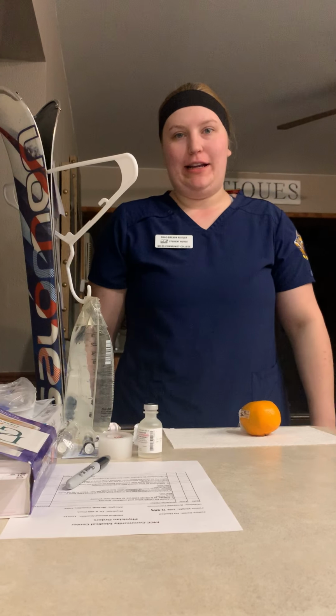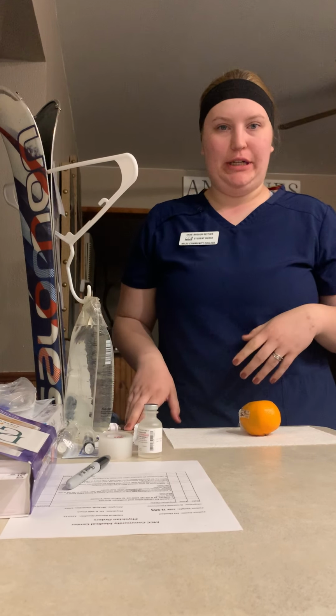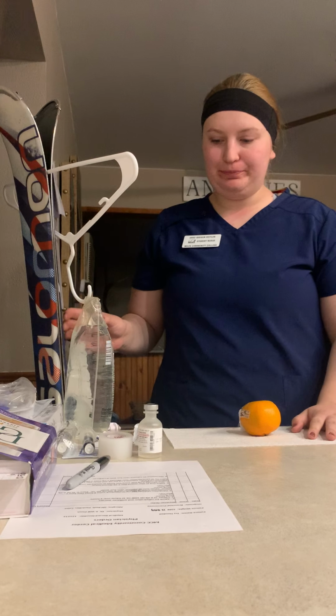Hi, my name is Shay Reitler, and I will be showing the skill of putting on an IV piggyback medication. So before I get started, I'm going to wash my hands.